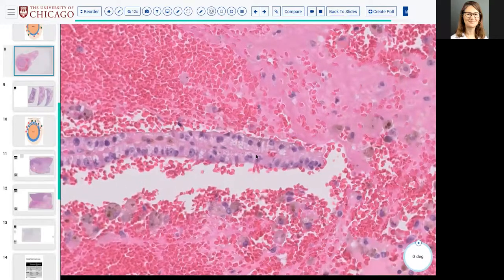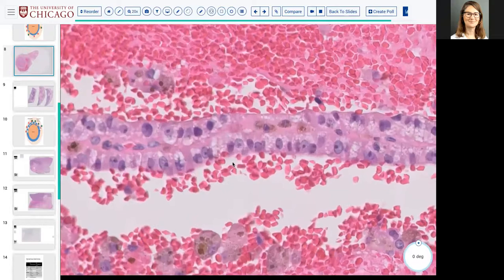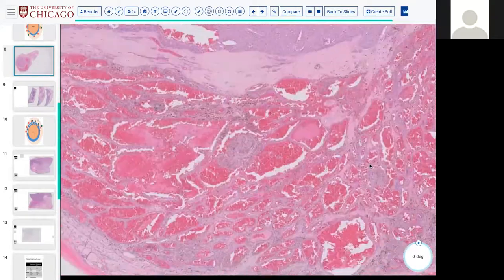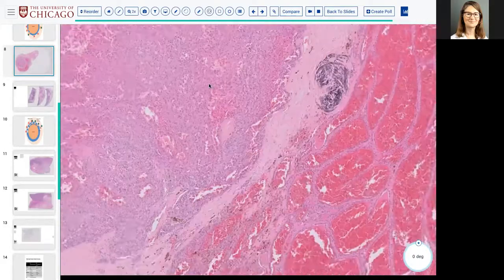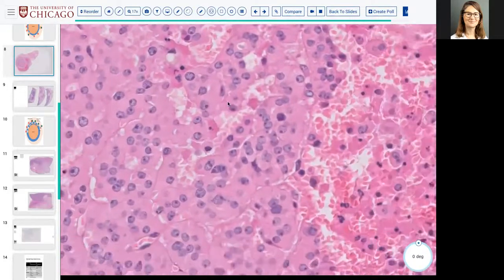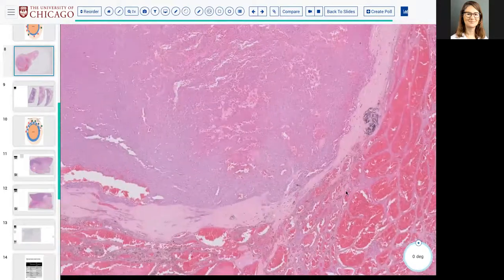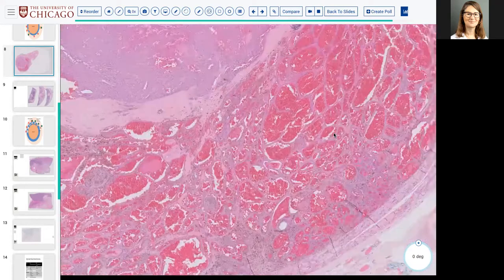Are we going to regard this as biologically important for papillary carcinoma, or are we going to disregard these? I'm going to disregard these. Great. Because when you get a Hürthle cell neoplasm that's quite florid like this, I don't think you're really thinking about this being a papillary carcinoma. So we can regard these as architectural artifacts.